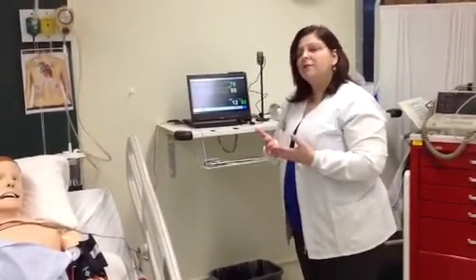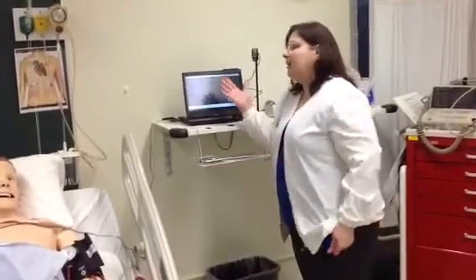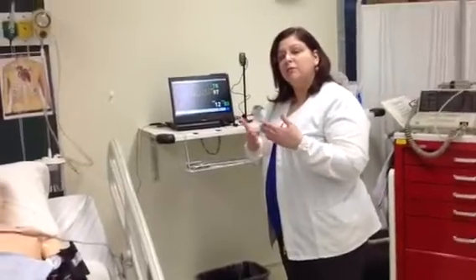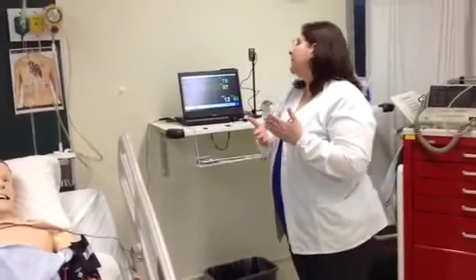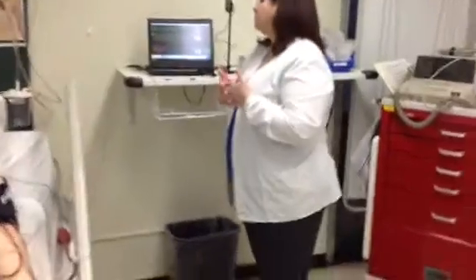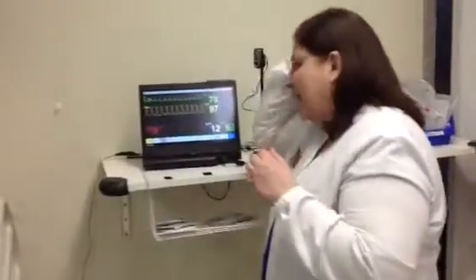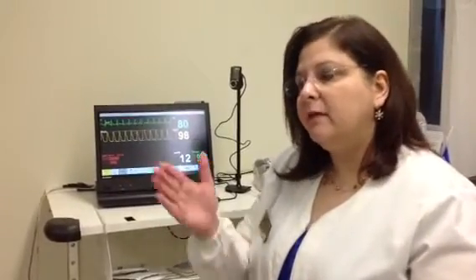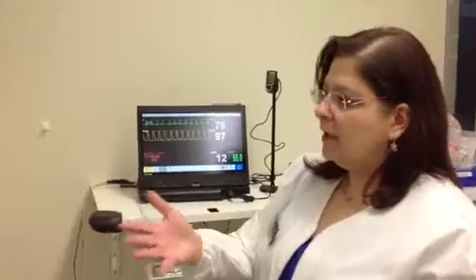I do understand that until you get to critical care, you may not have any idea what that rhythm means. However, you should understand that it looks regular, that it's at a regular pattern, and that is kind of what I expect at this level, is that you would recognize that at some point, if the patient's condition were to warrant you monitoring the heart closer, then you would put these leads on for him. The other thing that you can put on him is oxygen.